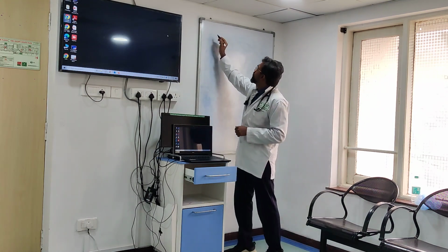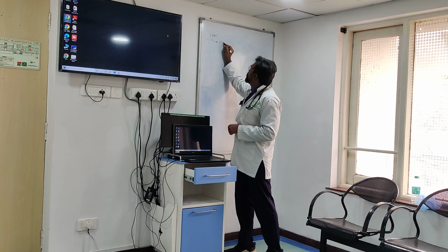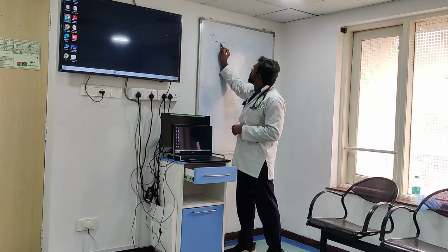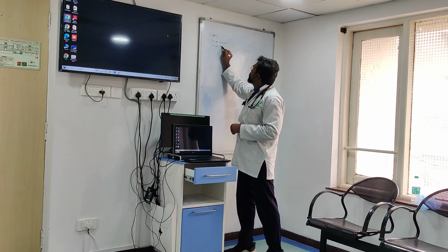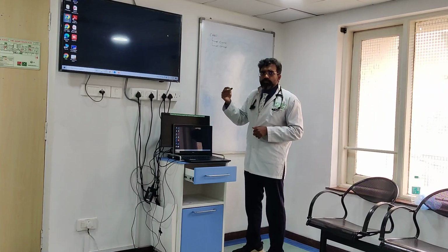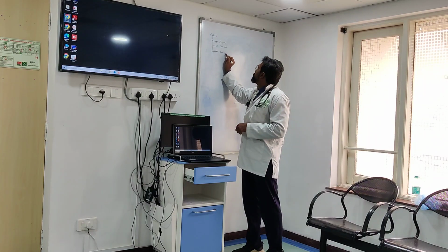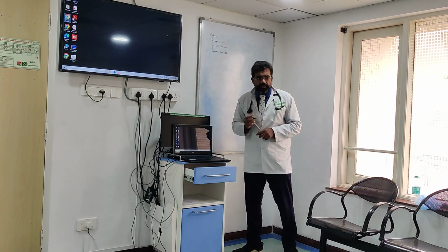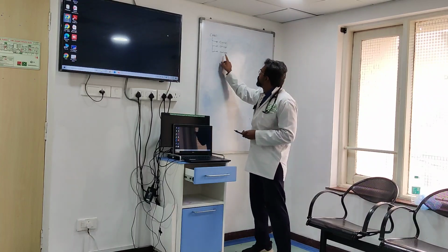Modalities of treatment, we are talking about CRRT, which includes CVVH, called continuous veno-venous hemofiltration. Then you have CVVHD, which is continuous veno-venous hemodialysis, and then the last one, CVVHDF, which is continuous veno-venous hemodiafiltration. Now you say veno-venous always now. There is also arteriovenous.